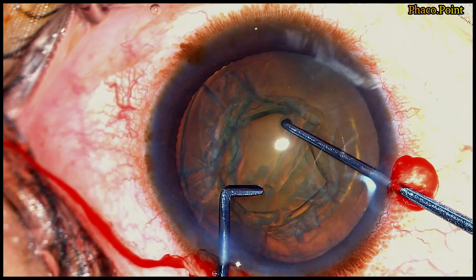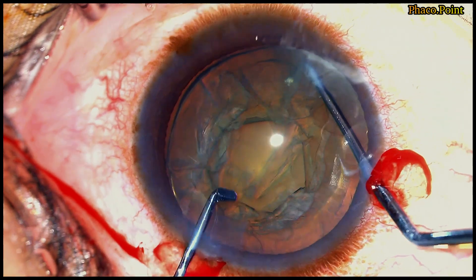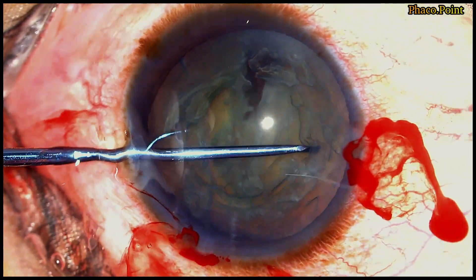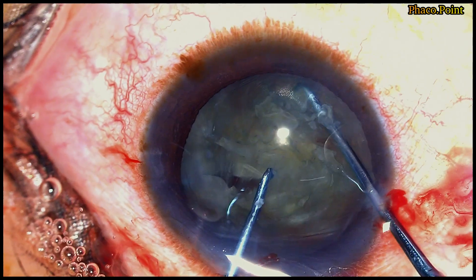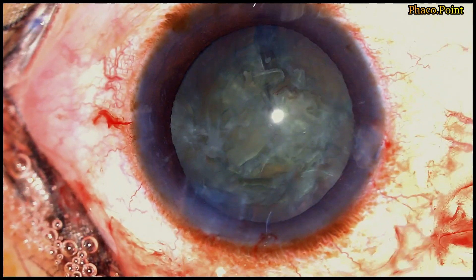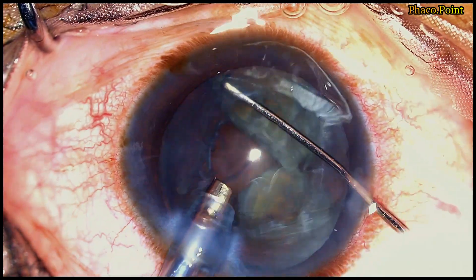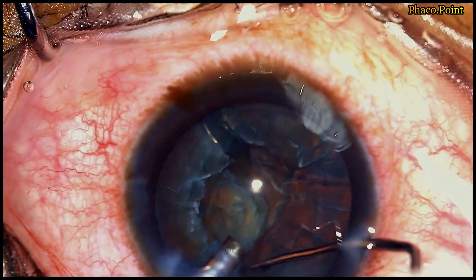Both instruments are introduced into the eye. The sustainer goes around and hooks onto the endonucleus, stabilizing it, while the chopper buries into the nucleus. Both instruments move towards each other and then there is a lateral separation, which facilitates the easy division of the nucleus into two heminuclei. Once more we watch the further subdivision of the nucleus into smaller fragments. The use of this pre-chopper makes the downsizing of the nucleus and the heminucleus so much easier in these patients with soft cataracts. The downsized fragments are all rotated in turn to come in front of the tip and are then elevated out into the pupillary safe zone and emulsified.